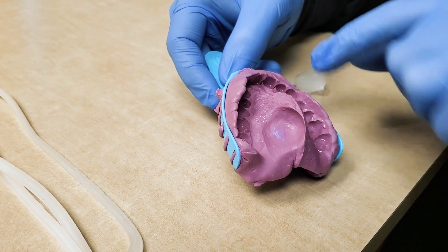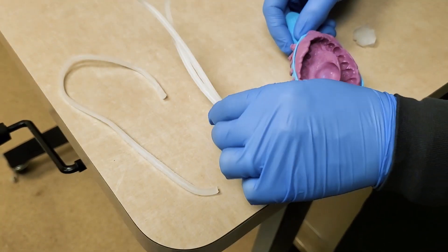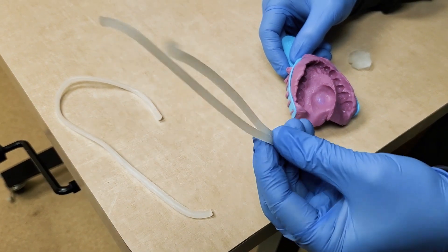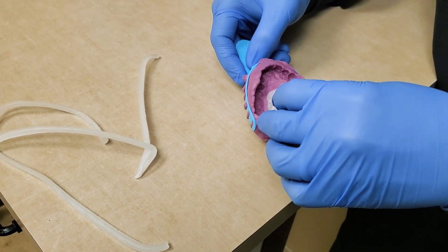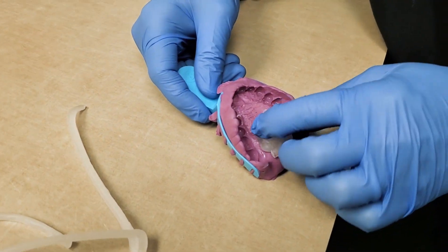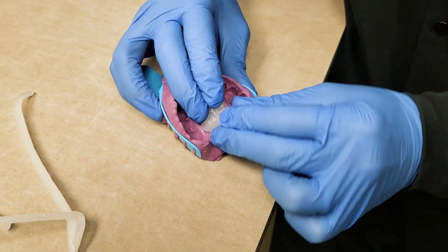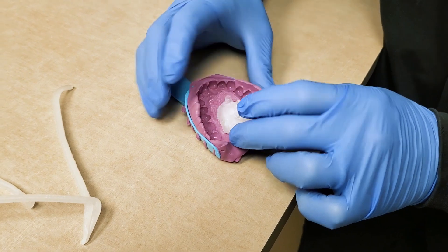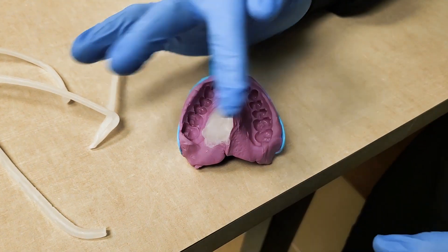When we pour this up and make a stone model, we want that void to be filled in. So I took some of this wax rope, which is pretty soft and pliable — you can kind of bend it and shape it. I made it into a little ball and then shaped it so that it fits into that defect in the impression.